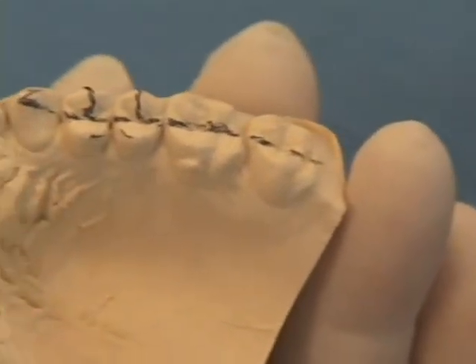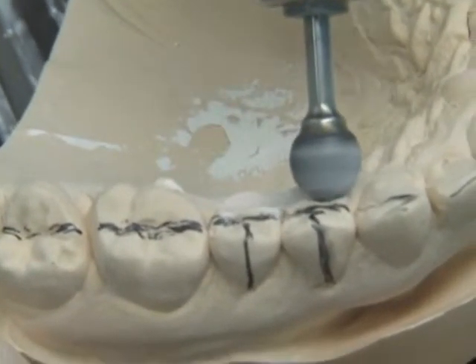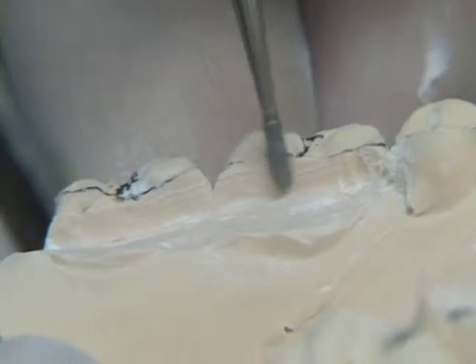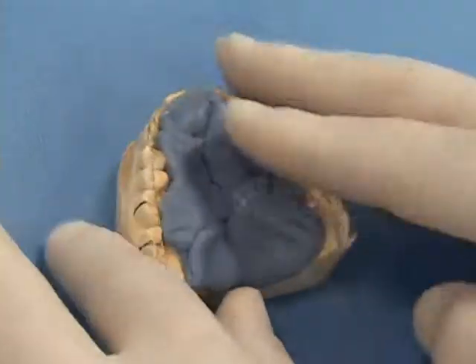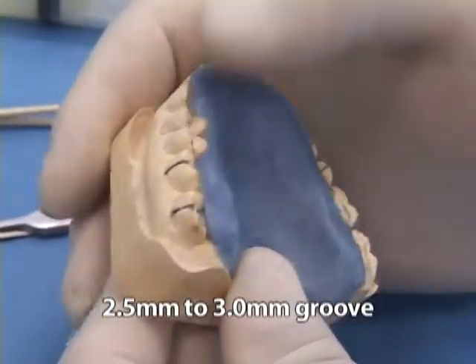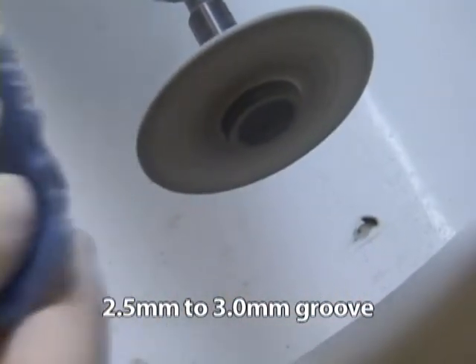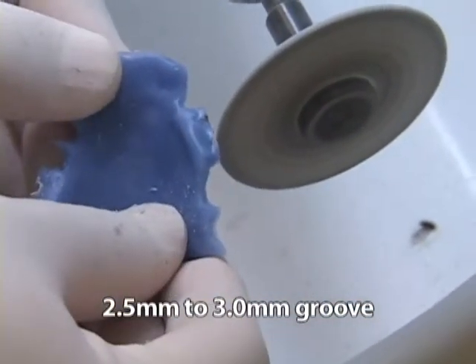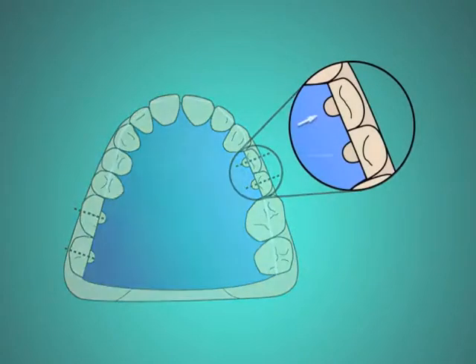Remove the stone representing the lingual half of the teeth to be replaced. Mold acrylic onto the lingual aspect of the modified model up to the level of the central fossa or incisal edge of the teeth to be restored. Cut a 2.5 to 3.0 mm wide groove in the acrylic, corresponding to the center and long axis of each intended tooth to be replaced.